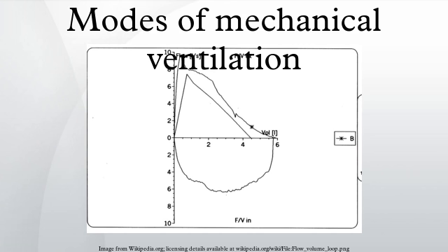Positive end expiratory pressure. Positive end expiratory pressure is pressure applied upon expiration. PEEP is applied using either a valve that is connected to the expiratory port and set manually or a valve managed internally by a mechanical ventilator. PEEP is a pressure that an exhalation has to bypass, in effect causing alveoli to remain open and not fully deflate. This mechanism for maintaining inflated alveoli helps increase partial pressure of oxygen in arterial blood. An increase in PEEP increases the PaO2.